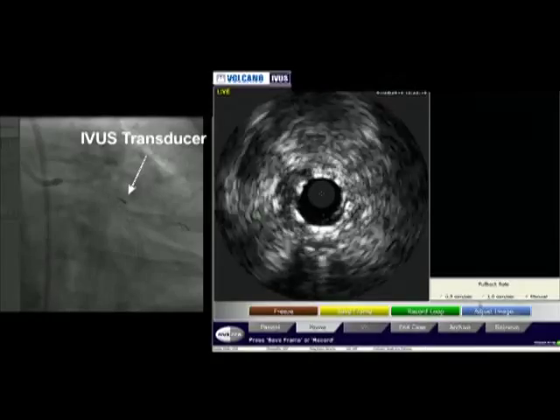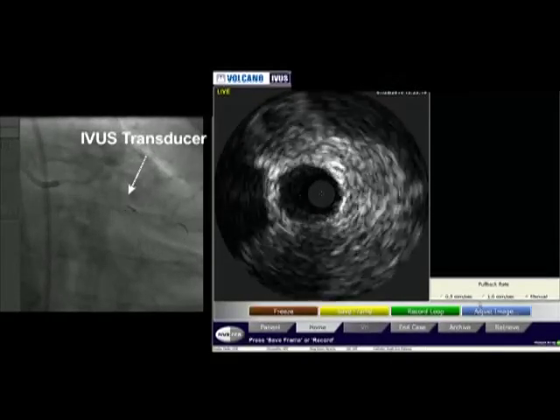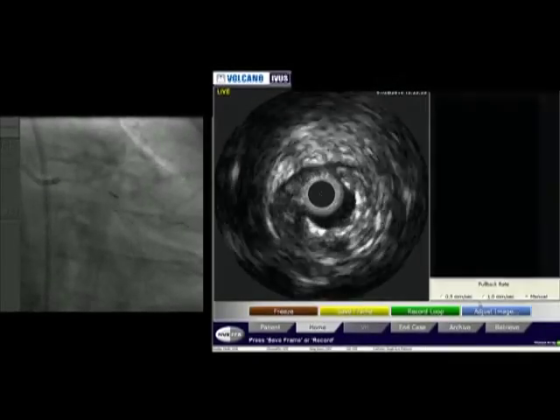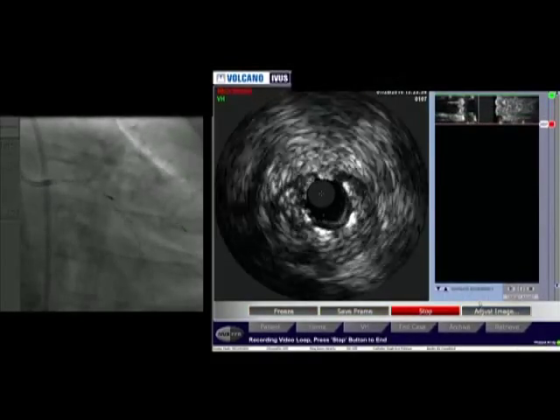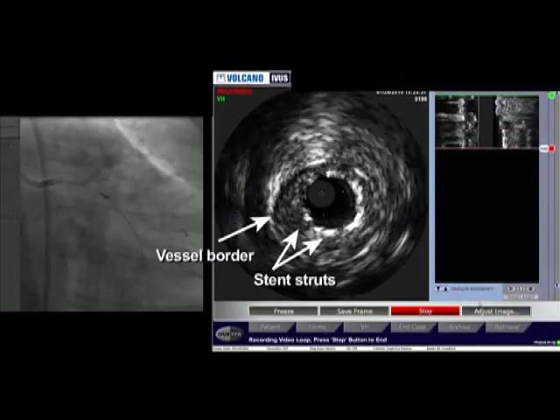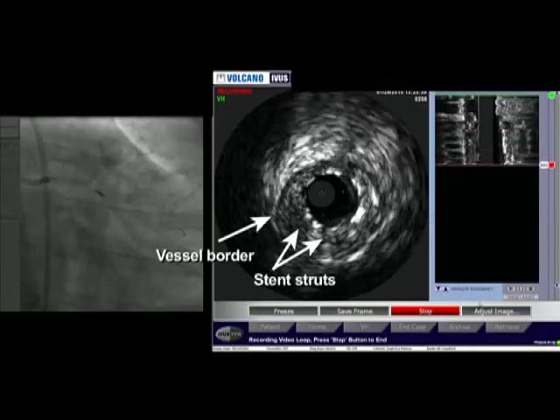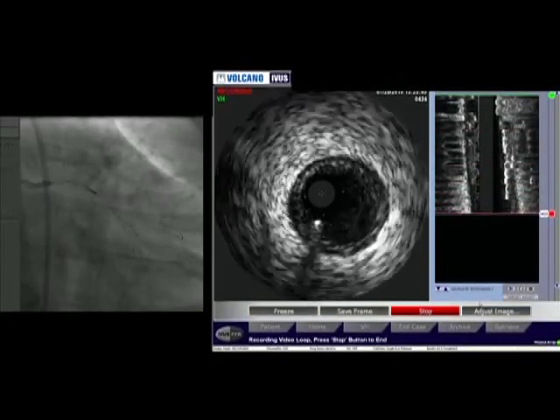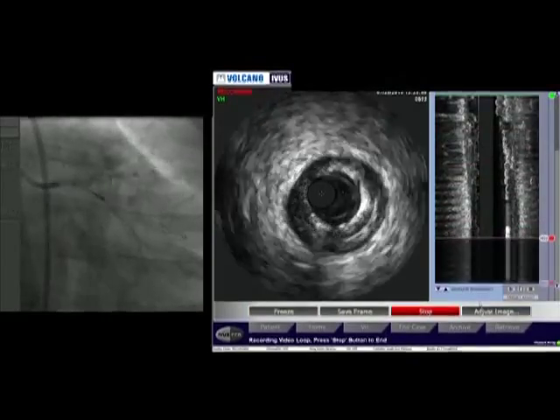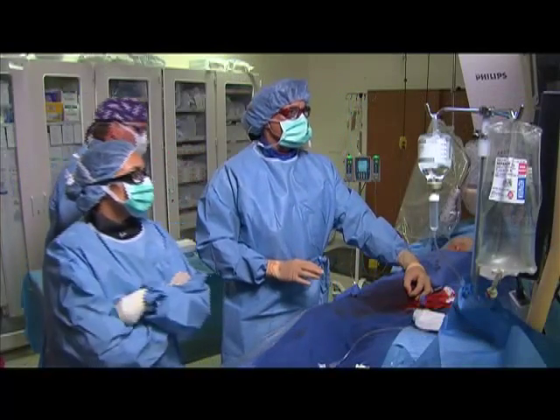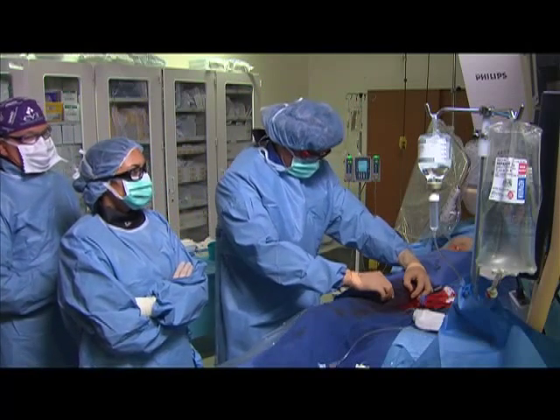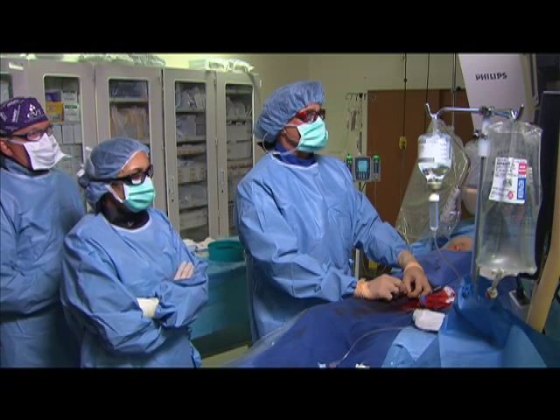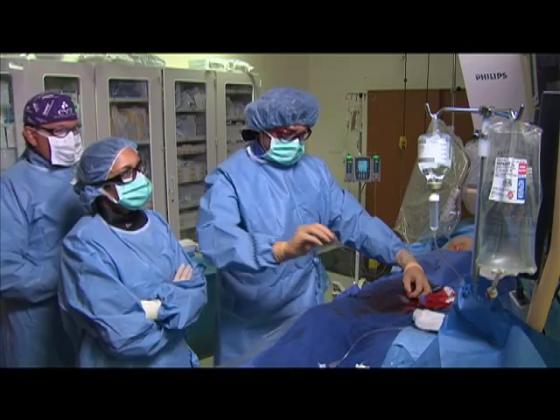The distal edge looks nice and the stent looks pretty good, but the vessel is very big. The stent is grossly undersized for this vessel — it's expanded but undersized, and you can see it's floating proximally. The proximal edge of the stent is grossly underexpanded. So we'll post-dilate. This is the purpose of IVUS — if we did not do IVUS in this area, we would leave the stent and the stent would thrombose, most likely, because it's a bifurcation with poor runoff.